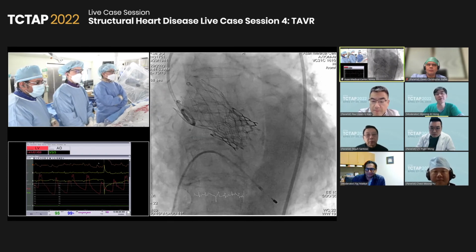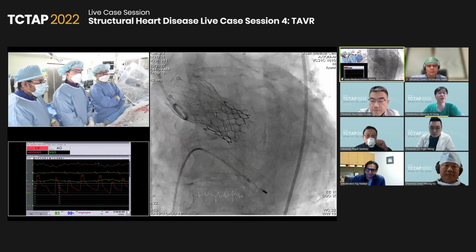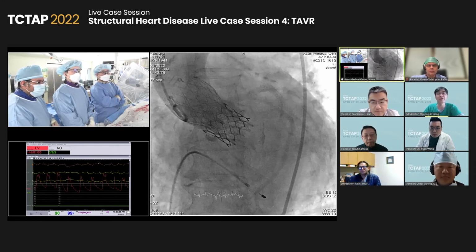Great. Okay. So overall, I think this case is very excellent. The procedure is excellent, and it is very educational. The excellent procedure. I'd like to say congratulations.